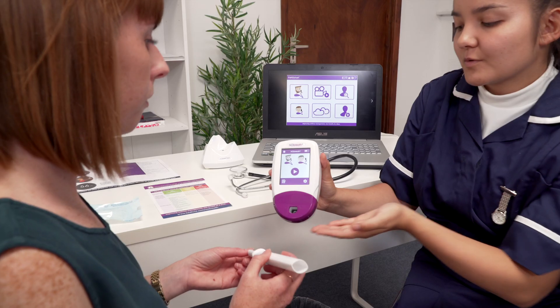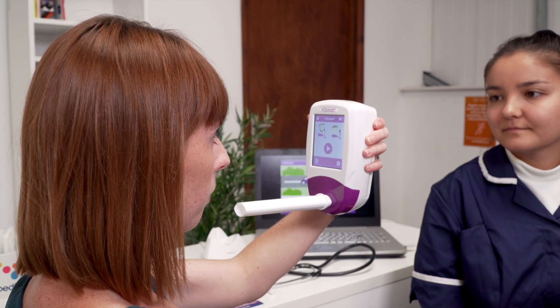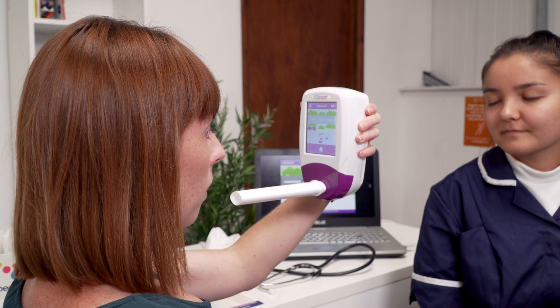To take a breath test, click on either the adult or child icon and attach a new mouthpiece to the unit. If needed, the test can be cancelled at any point by clicking the home icon.